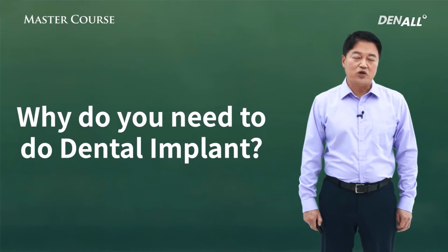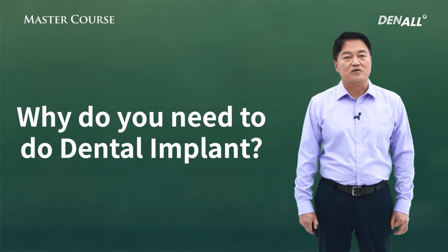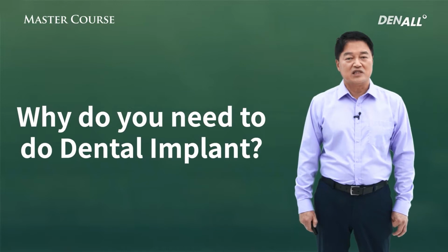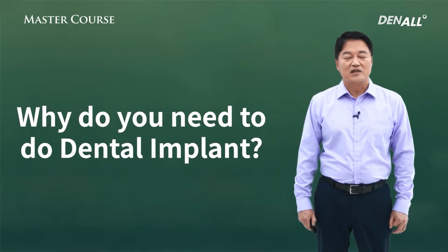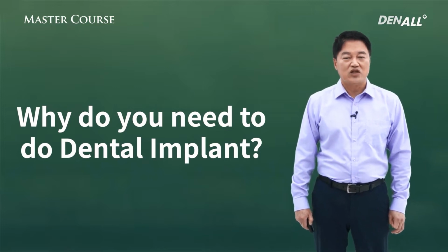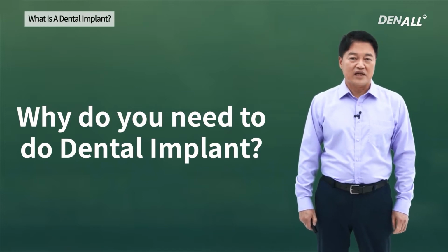Let's think. Why do you need implant? Before implant became more available, we provided bridges or dentures. However, as implant became more commercialized, the implant can cover a lot of disadvantages of bridges and dentures, and it has its own advantages. In the missing area, implant can provide optimum function. That is why implant is necessary.